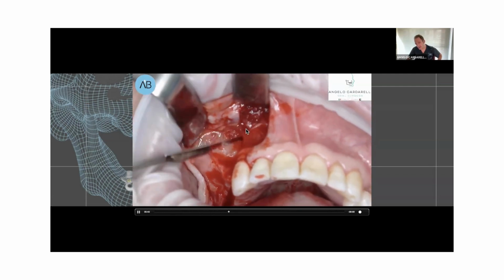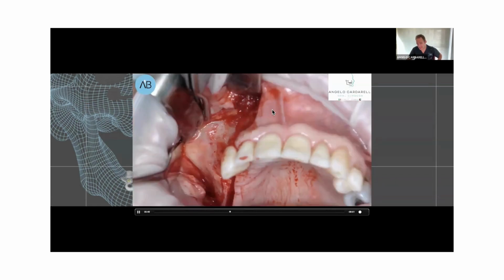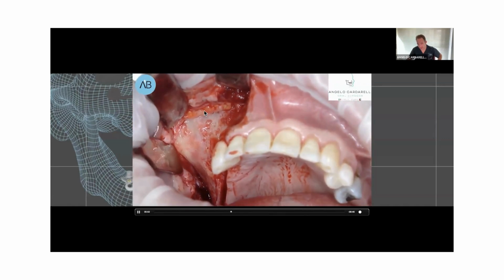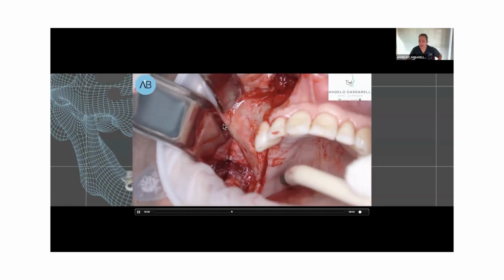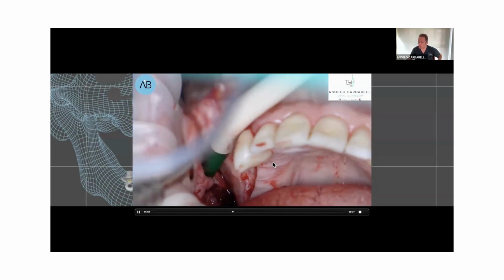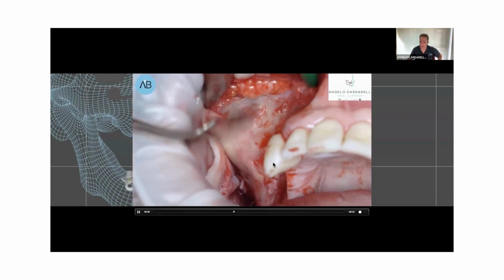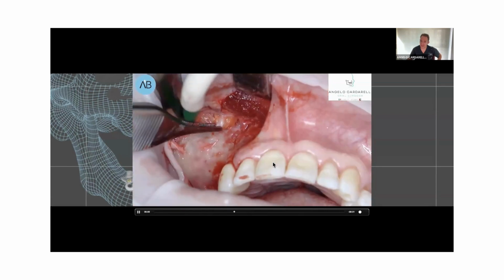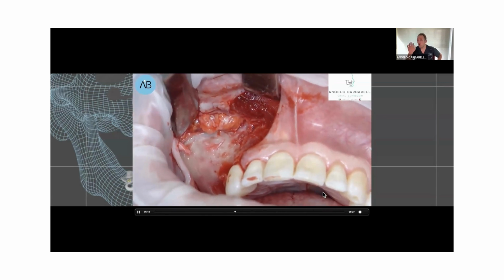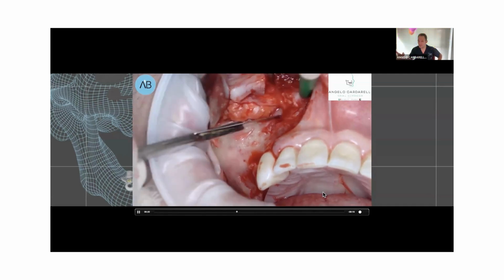And again, you can see here the periosteal incision to increase the length and the extension of our flap. Here we can see the fat. Now the view is much better, and we are ready to place the subperiosteal implants. And this is the fat. And you can see that when I will put the customized implant on the bone, this means perfect fitting.